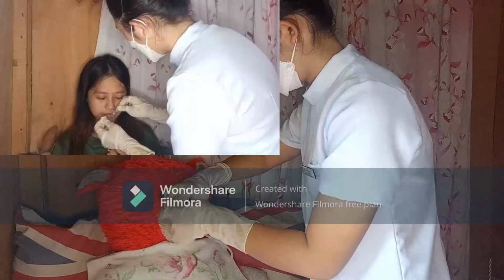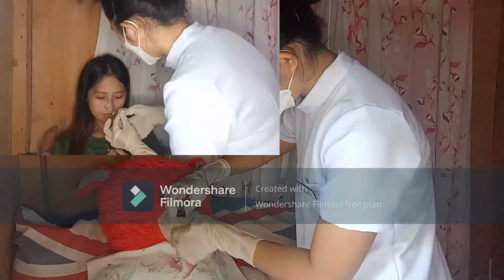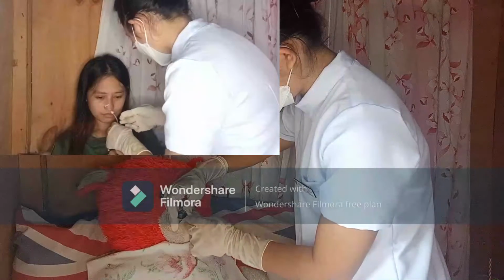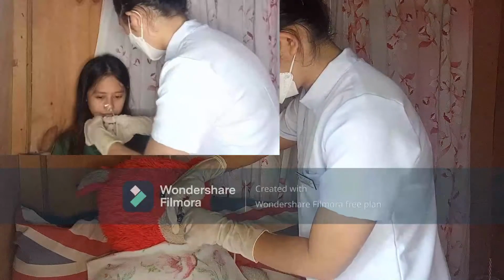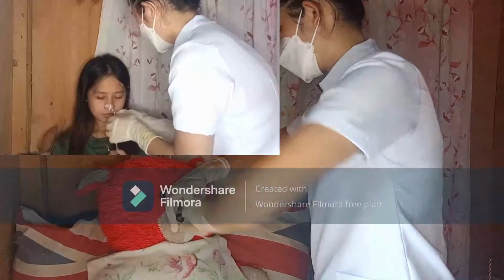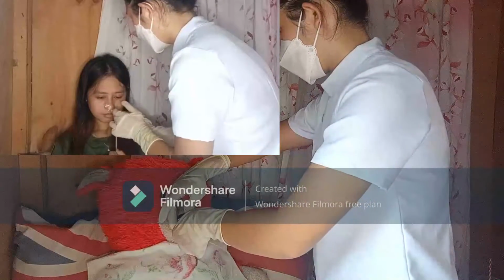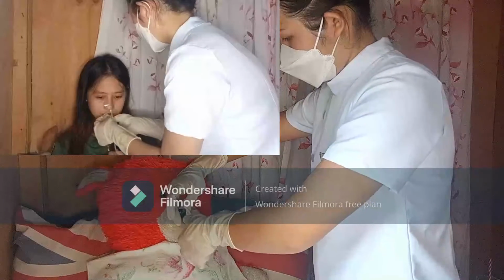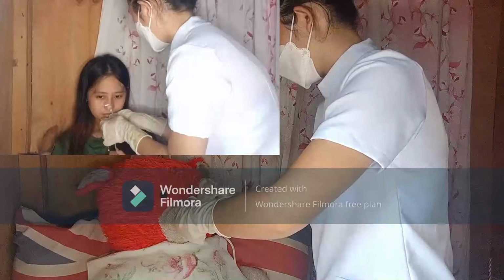Cut 7.5 cm or 3 inches of tape and split it lengthwise at one end, leaving a 2.5 cm or 1 inch stub at the end. Place the tape over the bridge of the client's nose and bring the split ends either under and around the tubing or under the tubing and back up over the nose.